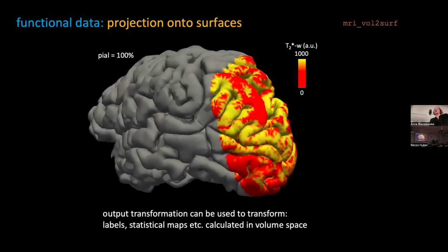And what I also wanted to point out, that John showed in his talk today but maybe not everyone realizes, is that we can also perform voxel-based analysis. We can basically take these two surfaces and the transformation and go back and calculate the depth for each voxel and proceed with the voxel-based analysis. So this is just to clarify that this is not the only way we can do analysis in this framework.